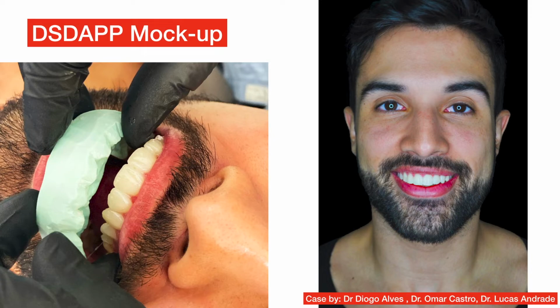And that's what we call in the DSD the wow factor. It's when you are engaging the patient with this new smile that he or she helped design.